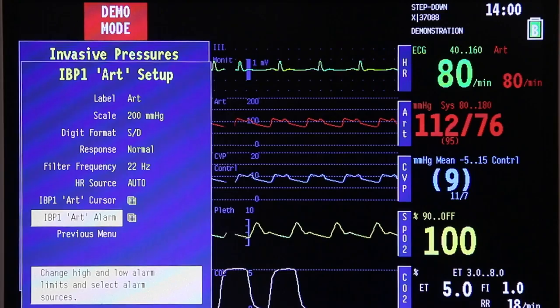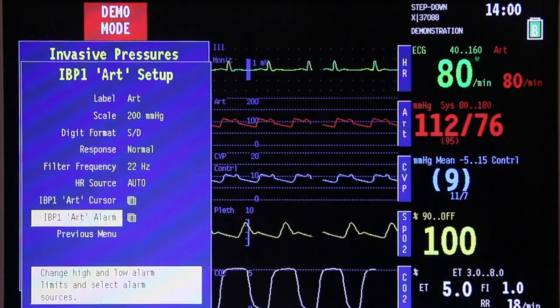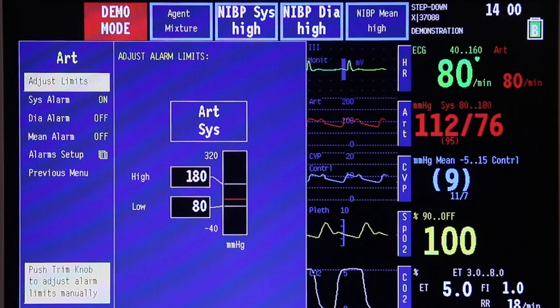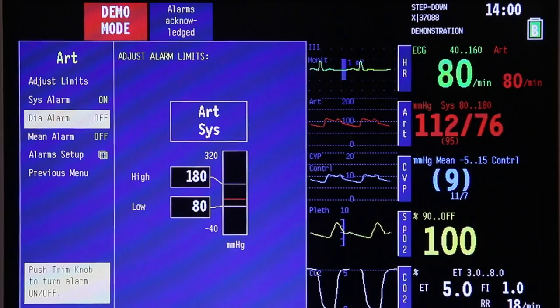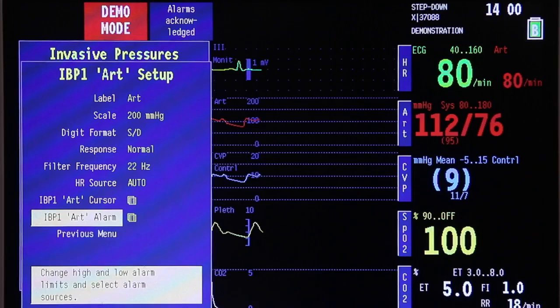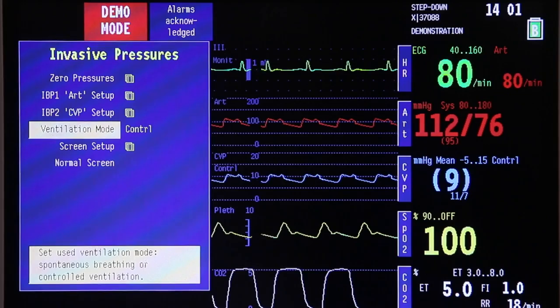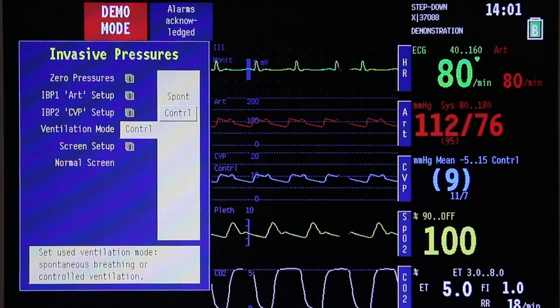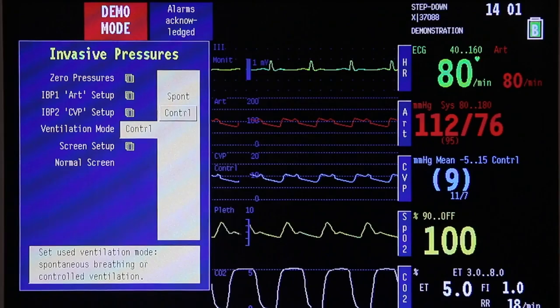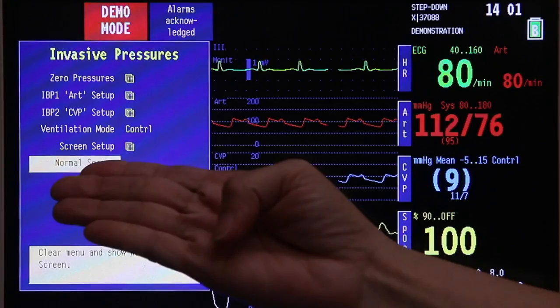IBP alarm can be adjusted either from the alarm setup menu or from this option. Here, you can adjust the upper and lower limits of your arterial blood pressure. Once done, go back to previous menu. Next, the monitor will ask for the ventilation mode of your patient — whether your patient is on a ventilator or breathing spontaneously. Choose the option that is applicable, press the trim knob, and then go back to the normal screen.